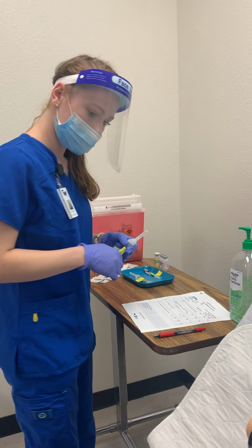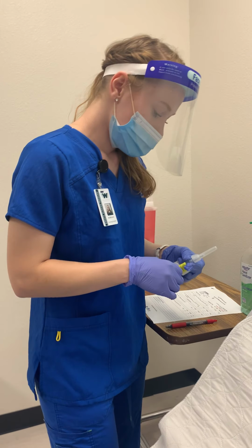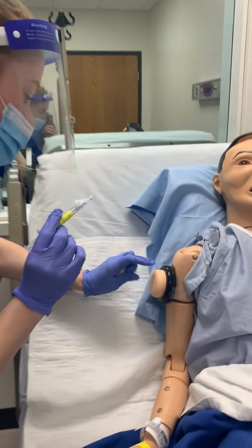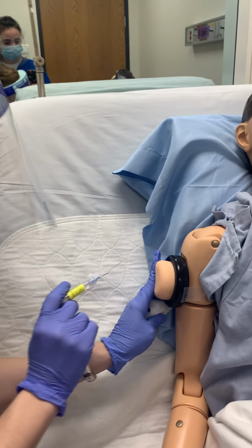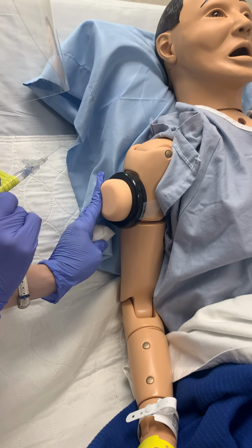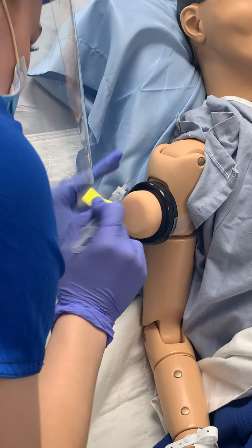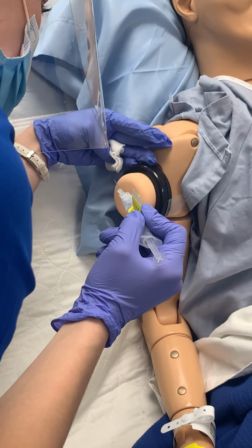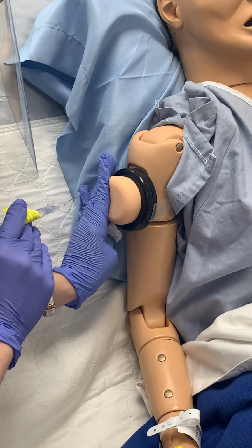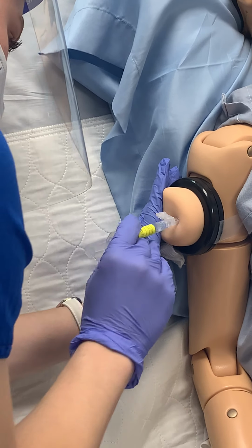Okay, Shirley. So this is just going to be an injection, and I'll count down with you, okay? And then I'm going to pull to the side, okay, Shirley? And I'm going to go at a 90-degree angle, okay? Okay, perfect. 1, 2, and then I'm making sure it's 3 fingers. It's kind of hard to get on your arm, but we'll have that. And then I'm going to pull laterally, and then ready, Shirley, we're going to go 1, 2, 3.